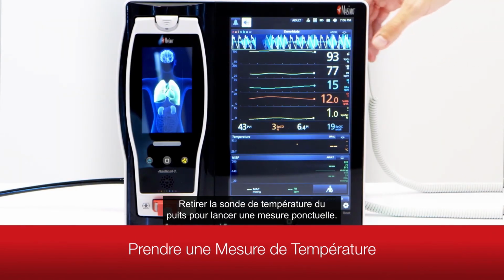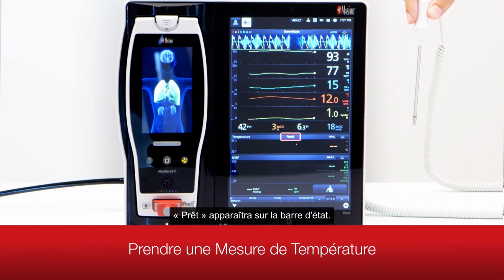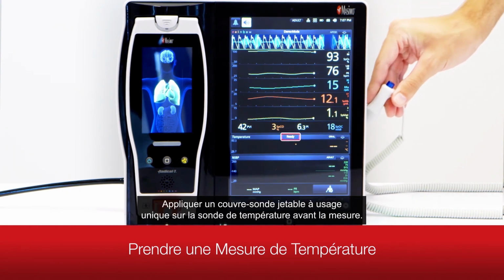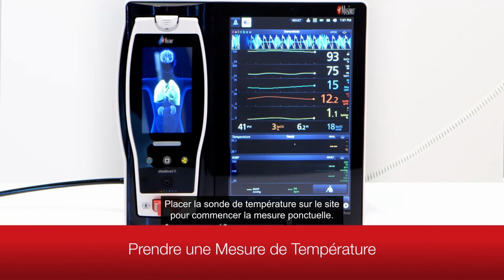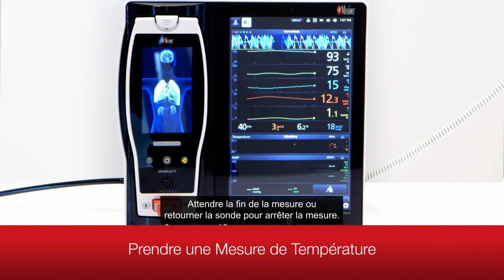Remove the temperature probe from the probe well to initiate spot check. Ready will appear in the status bar. Apply a single-use disposable probe cover to temperature probe before measurement. Place the temperature probe on site to begin spot check. Wait for measurement to complete or return probe to abort measurement.